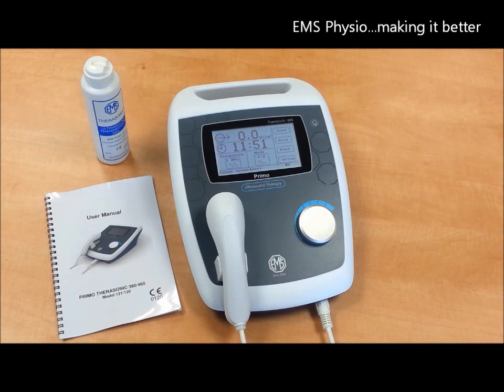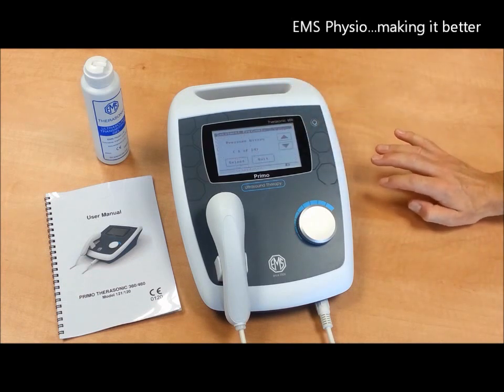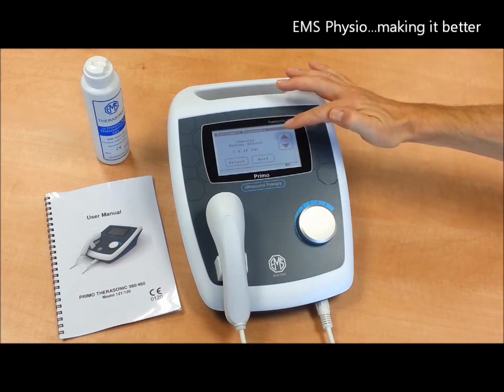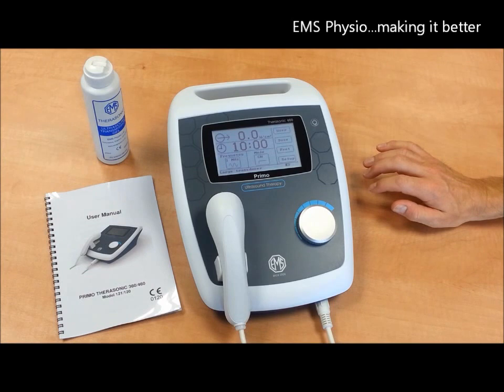A few other features of the Therasonic 460 are that you can apply the correct settings according to the type of injury you wish to treat. These protocols have been established specifically for EMS Visio by Professor Tim Watson of the University of Hertfordshire and are based on the proven results from published clinical trials.